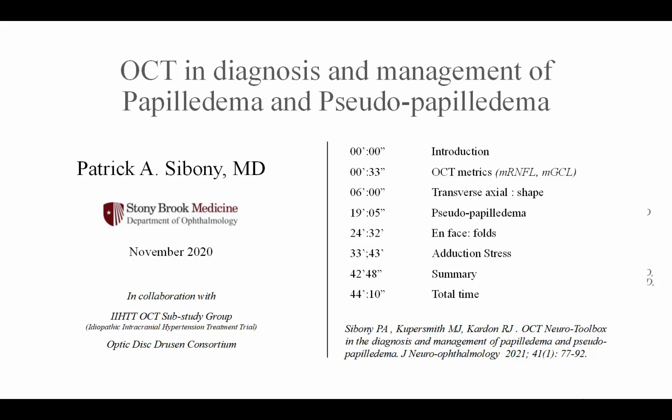I'm going to be discussing the use of the OCT in the diagnosis of optic disc edema and pseudo-papilledema. This is in part a collaborative effort that was based on data that I was fortunate enough to have access to as a member of the OCT sub-study group and the Optic Disc Drusen Consortium.